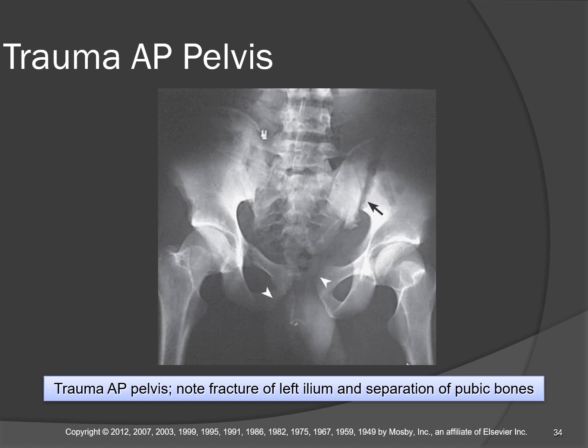Sometimes, you got to weigh the importance of removing the artifact. In the ideal situation, all artifacts would be removed. Okay.